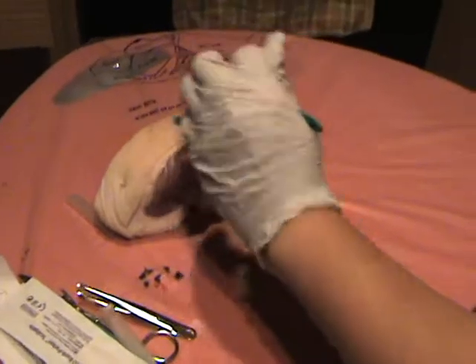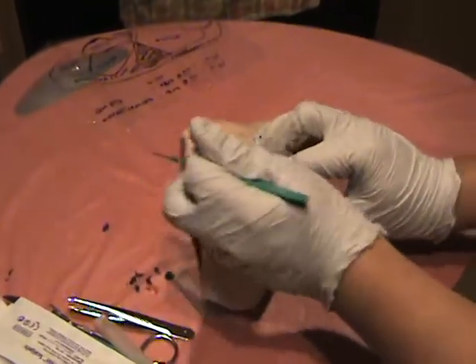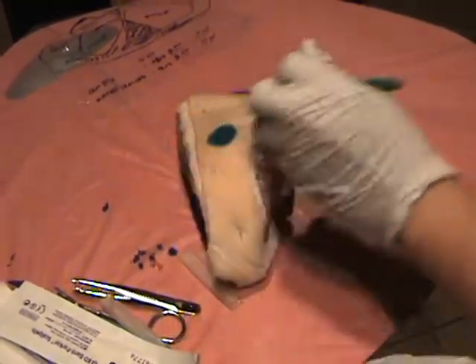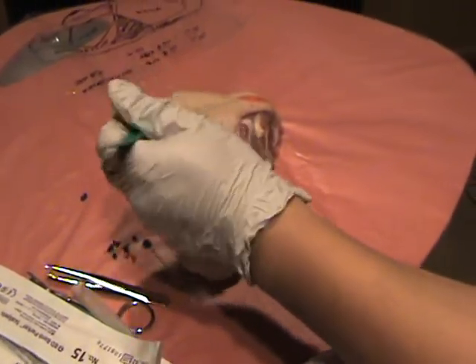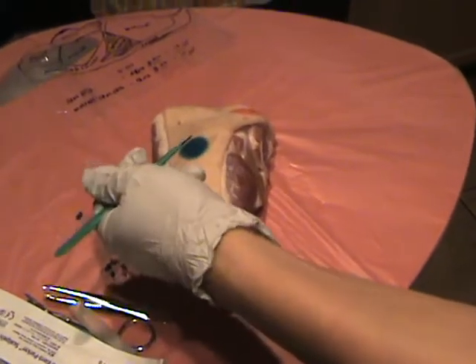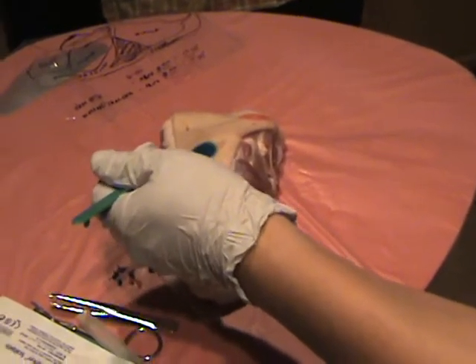And the direction of cut would be parallel and then perpendicular, like a tic-tac-toe. And we shouldn't be exposing any white spot over there, so the depth of the cut would only stay on the blue dye.